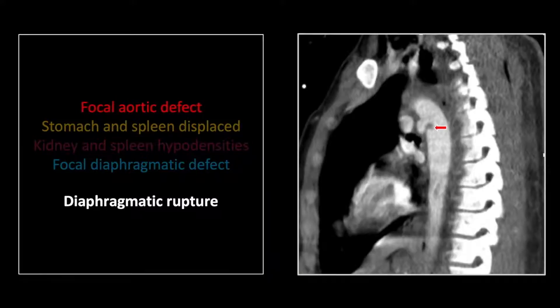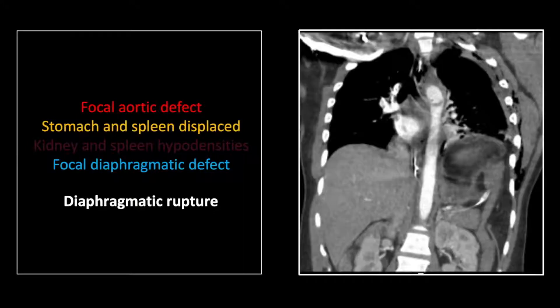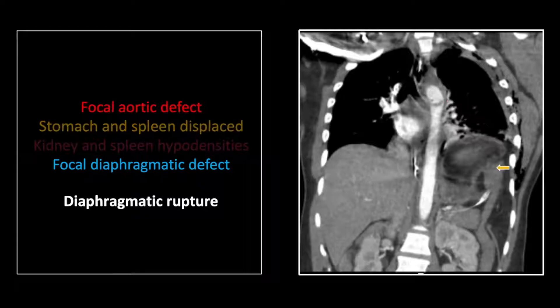On the sagittal view, there is the intimal flap and associated pseudoaneurysm of the isthmus laceration. There it is again on the coronal.